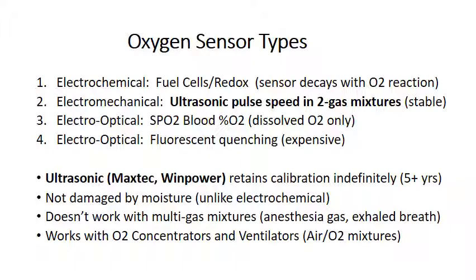And it's ideally suited to oxygen concentrators and ventilators, which have only an air and oxygen mix. And it retains its calibration indefinitely, at least 5 years.